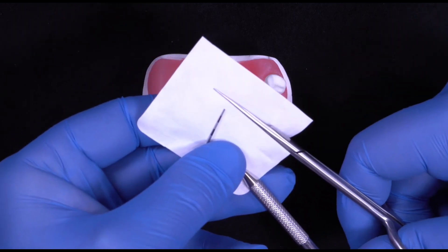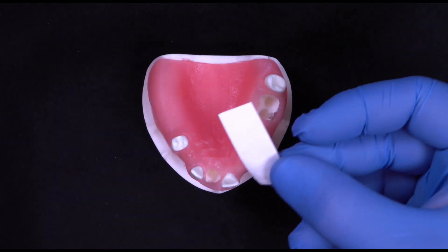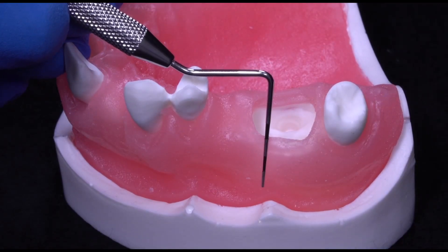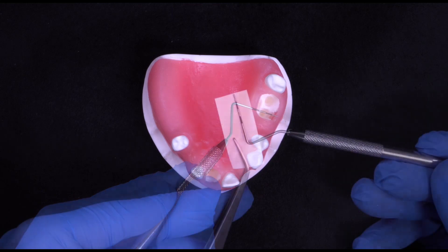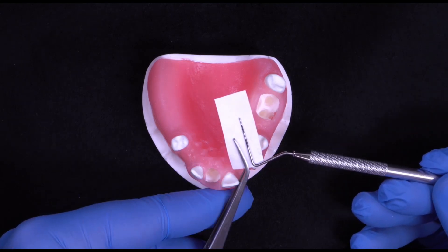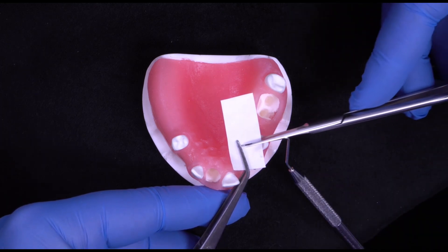The width of the extraction site is transferred to the template and cut to size. The length of the template is measured and transferred, ensuring the guide is long and wide enough to extend past the extraction site, allowing it to be tucked between the bone and the soft tissue providing a barrier.